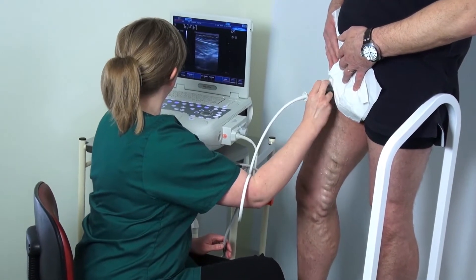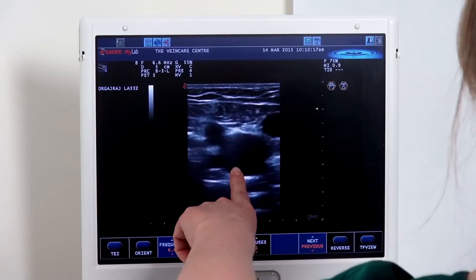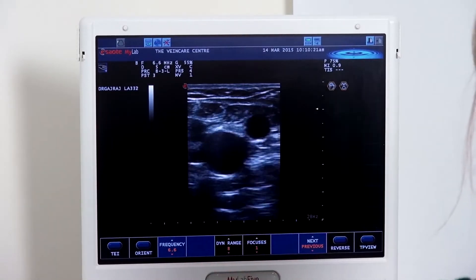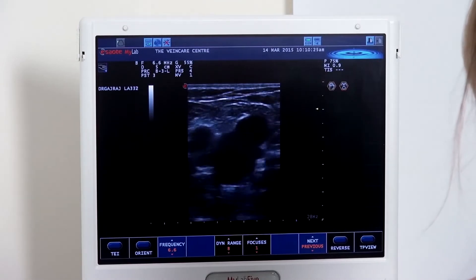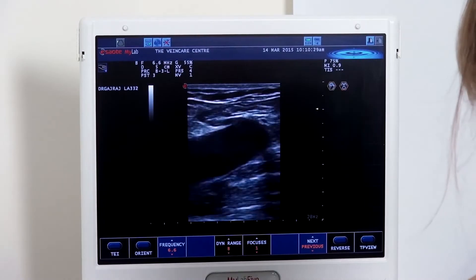This picks up our junction with the common femoral vein, the deep vein, the common femoral artery, and the saphenofemoral junction — and we get our Mickey Mouse sign just there. Most importantly, to start off, we assess the deep venous system to check for deep venous competency.